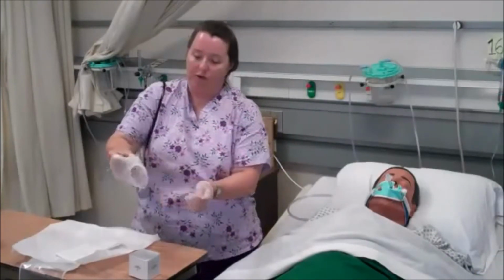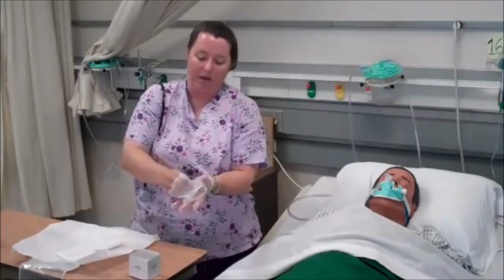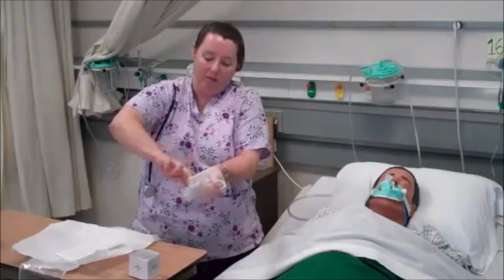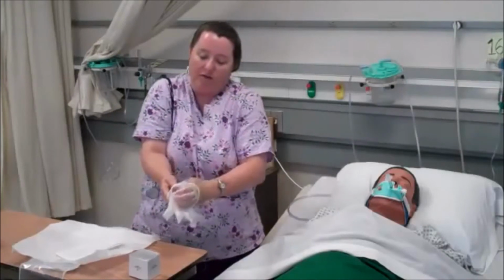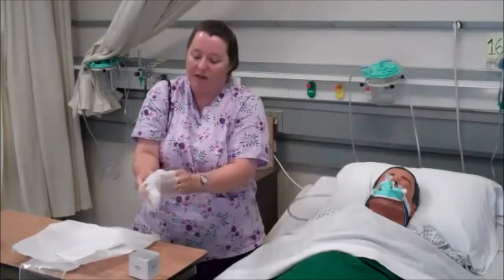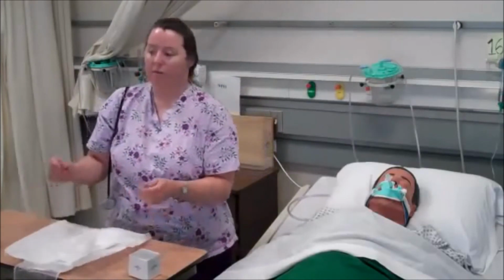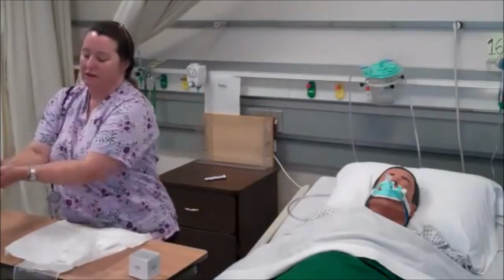I'm going to remove the catheter inside of my glove. Now making a mitt inside my hand, I'm going to reach under, pull the gloves over so that I'm not touching any kind of secretions that may contaminate myself. I'm going to put these down, I'm going to throw away my equipment, and I'm going to wash my hands.